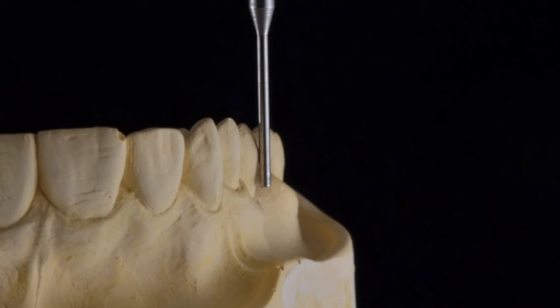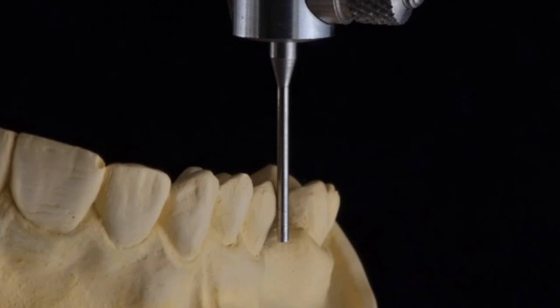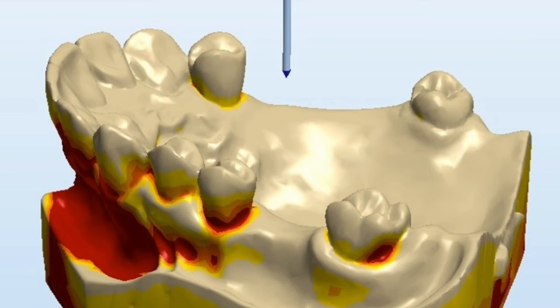So this is a closer view of how much undercut you have, and when it's tilted severely toward that area, you notice the increased amount of undercut present on the buccal surface. This is a determinant of how much retention you will have with the metal framework. So in digital analysis, this color shows the amount of undercut present. Yellow color is showing 0.01 inch undercut gauge, the orange color is showing 0.02 inch undercut, and the red color means 0.03 inch undercut.